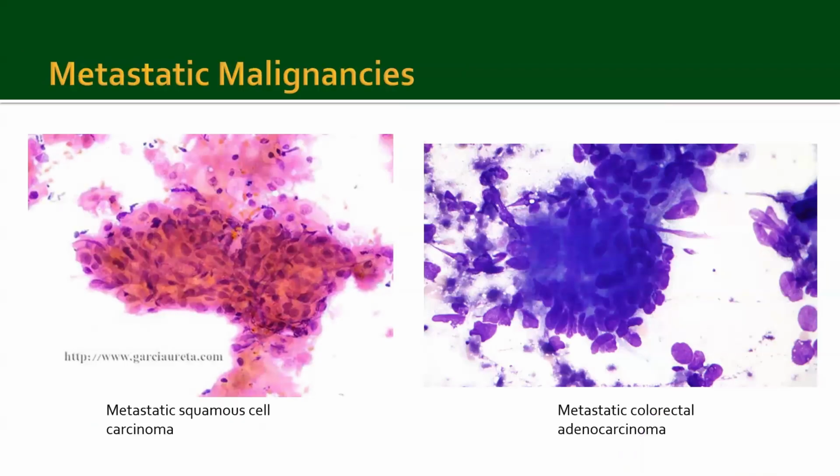Just some more images of metastatic malignancies. I put an image of a metastatic squamous cell carcinoma as well as a metastatic colorectal. I included the colorectal specifically because of the fact that cholangiocarcinoma is an adeno.